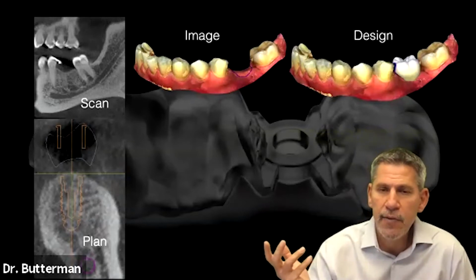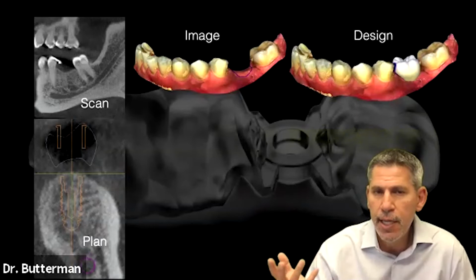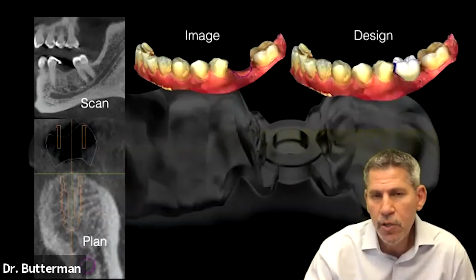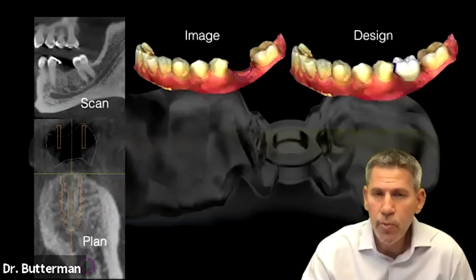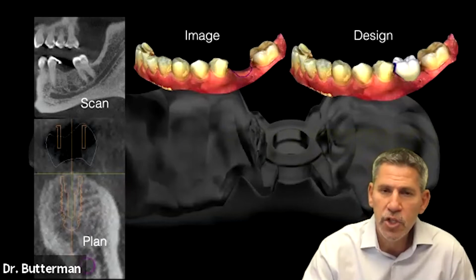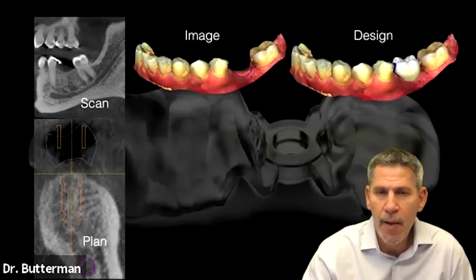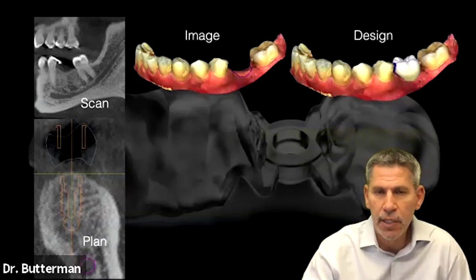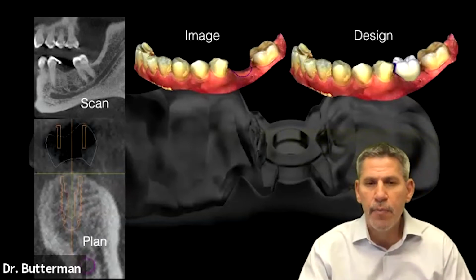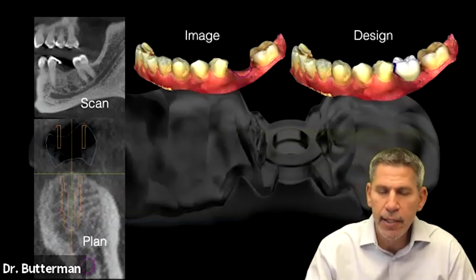And if they're deficient in bone and they're missing it, I can have another conversation. I can say, look, that's the implant I want to place, but you don't have enough bone for it. We need to do some grafting here. And the patient's like, oh yeah, I can see that. And that's a very different conversation than just giving them an itemized shopping list where you add grafting on top of it, because they're just like, what the hell, why do I even need that? So we're kind of letting the patient co-diagnose.